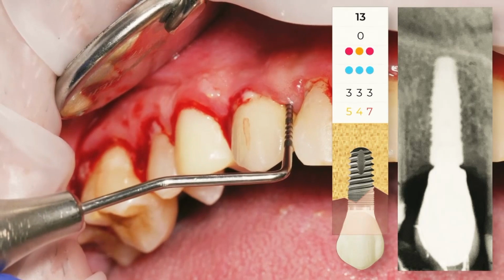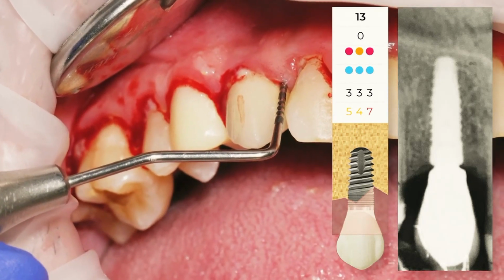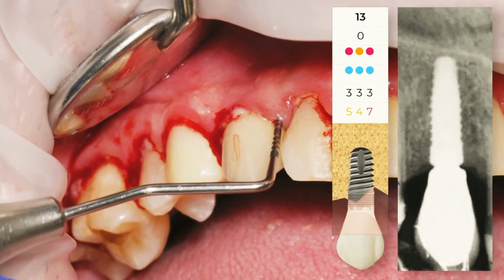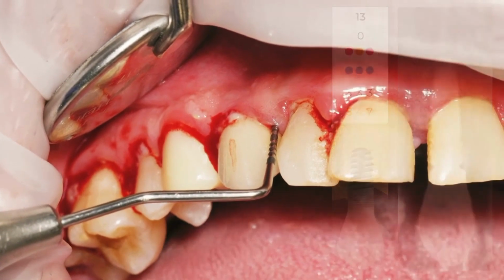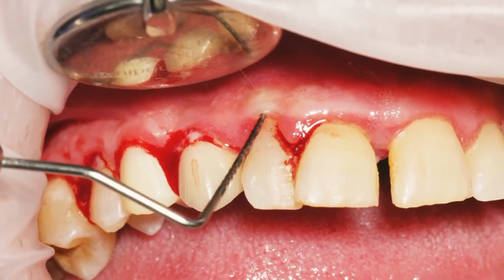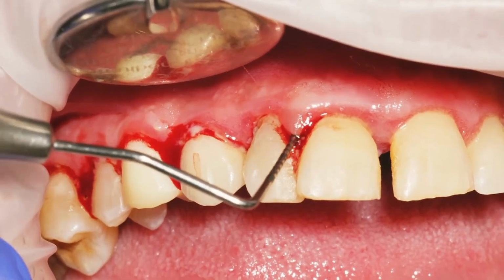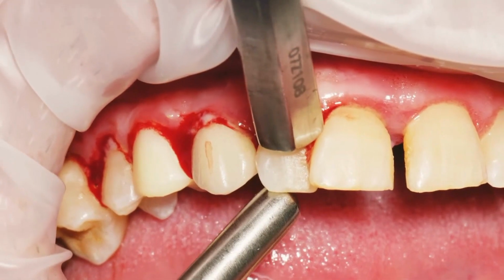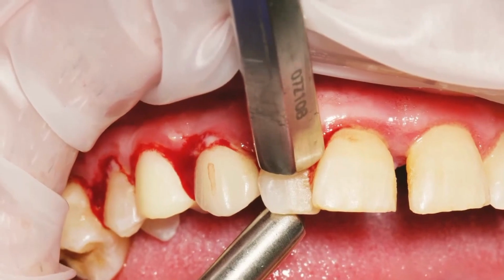For example, on this implant, we have 5, 4, 7 millimeters in the buccal aspects, but we don't have any bone loss. So we have a severe mucositis with severe and profuse bleeding on probing, and a lot of supragingival plaque.